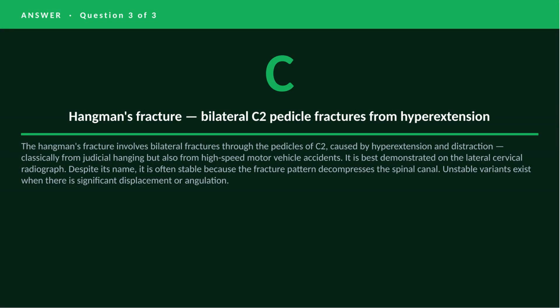The answer is C. Hangman's fracture, bilateral C2 pedicle fractures from hyperextension. The Hangman's fracture involves bilateral fractures through the pedicles of C2 caused by hyperextension and distraction. It is best seen on the lateral cervical radiograph.